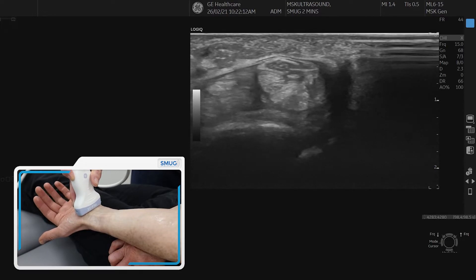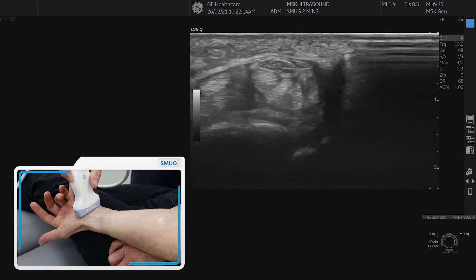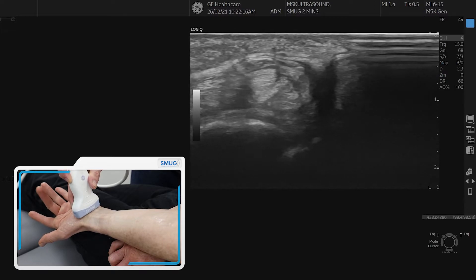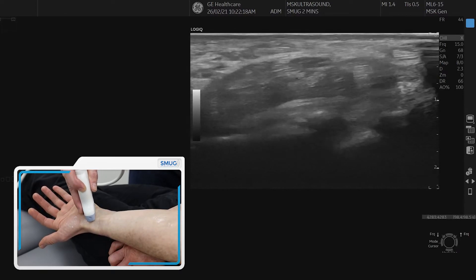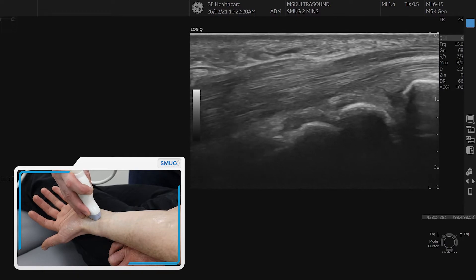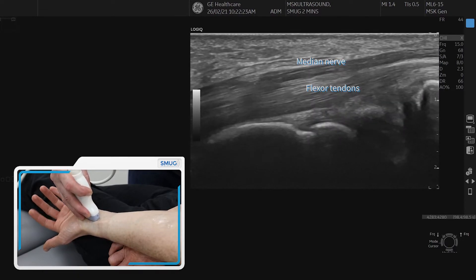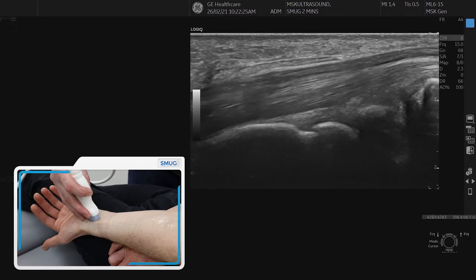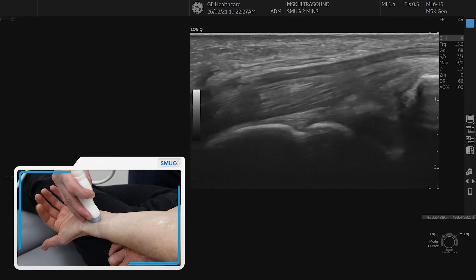If the patient wriggles their fingers a little bit, you can see the median nerve has a different movement dynamic than the tendons on top. You can spin on it — the median nerve again lies superficial to the tendons, is normally a bit more hypoechoic, and if you wriggle your fingers again you can see there's a different dynamic to that.